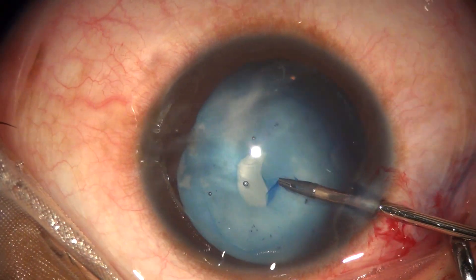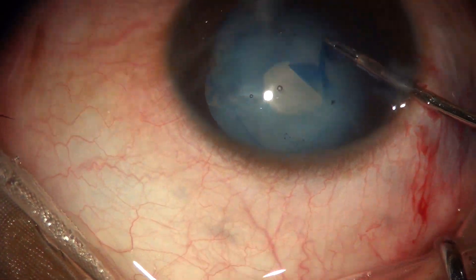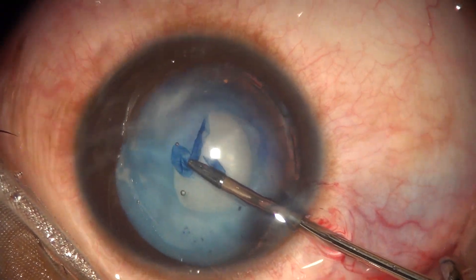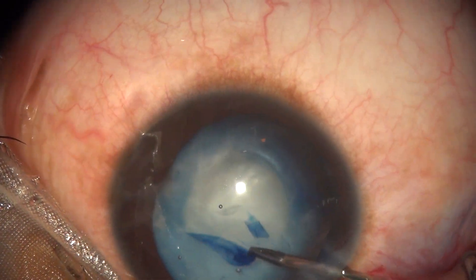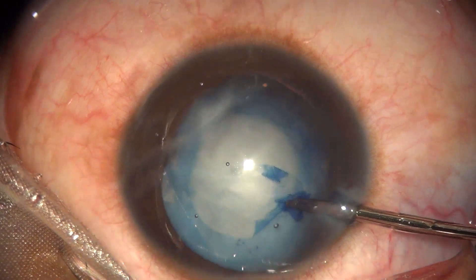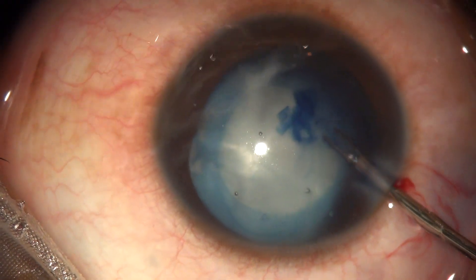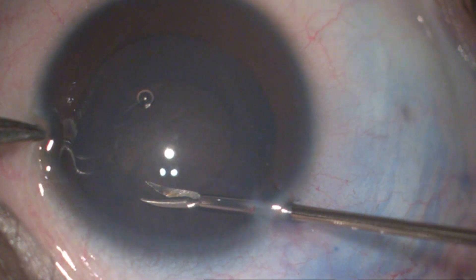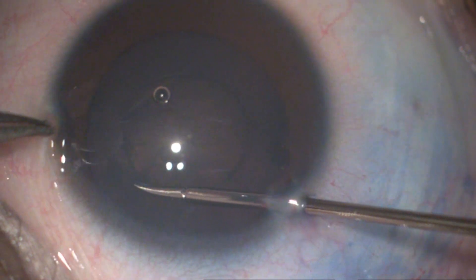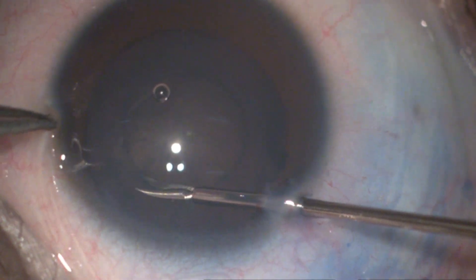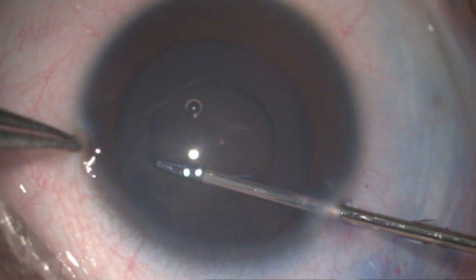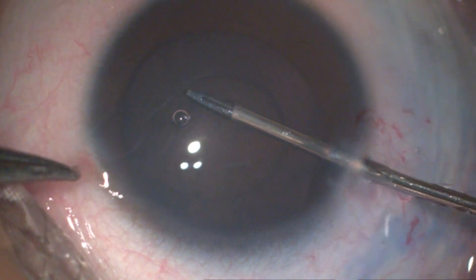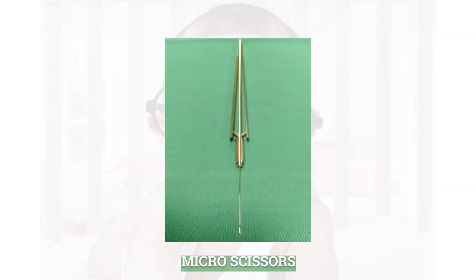A spiral technique can be tried for a more controlled capsulorexis whenever there is risk of peripheral runoff. If the capsulotomy is not adequate, it can be extended by giving a tangential extension using micro-scissors.